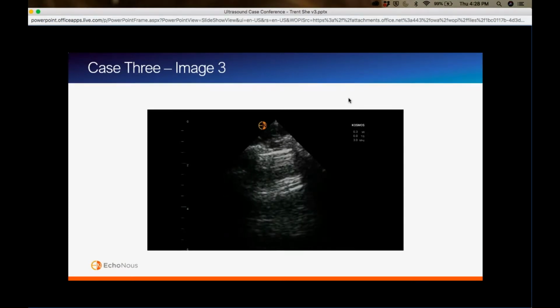I wouldn't rule out a pneumothorax though if you can't see a lung point. It's not that sensitive. You have to find that spot, and so it helps you with ruling in for sure, but I wouldn't necessarily use it as a rule out tool. Yeah, no, I agree. It's very specific, but not sensitive.